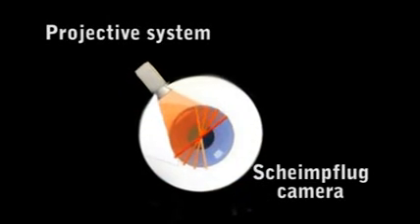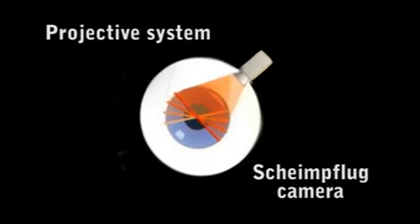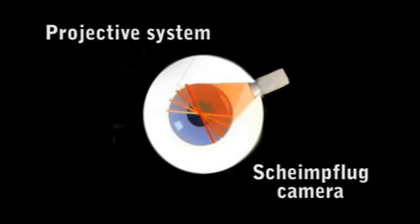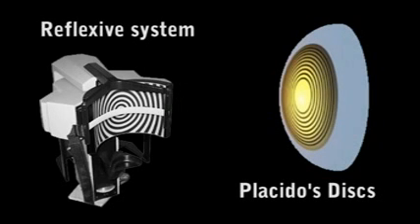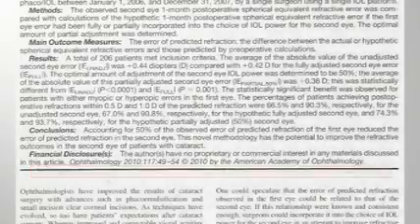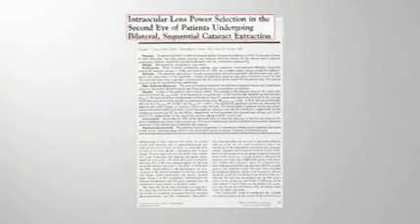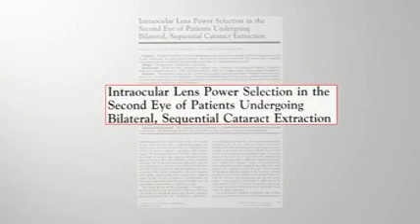Elementary functional principles of the different technologies employed for the analysis of the anterior segment of the eye, as well as the advantages and limitations of each one, must be clearly kept in mind by the cataract surgeon. The alternative use of technology not dependent on corneal transparency was capable, in this case, of providing more accurate and reliable data. Summarizing what we learned from this case, as described by Couvert et al., postoperative refraction of the first operated eye offers a valuable tool in terms of refractive prediction for the fellow eye.